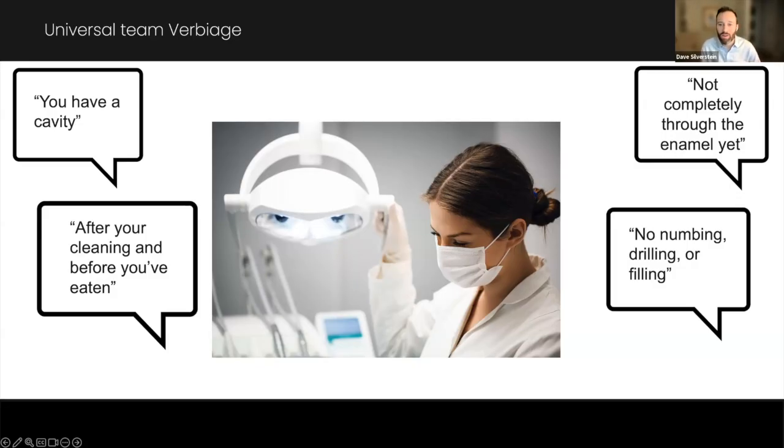I will be honest with all of you. I was apprehensive years ago about how my patients were going to take this. But after doing it every day for a few years, I will tell you quite simply, when we find these lesions, it is a celebratory conversation. It is not bad news. I mean, the patients are literally like, oh, thank you. We don't have to do any drilling.